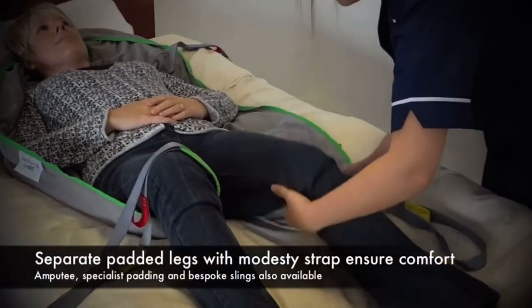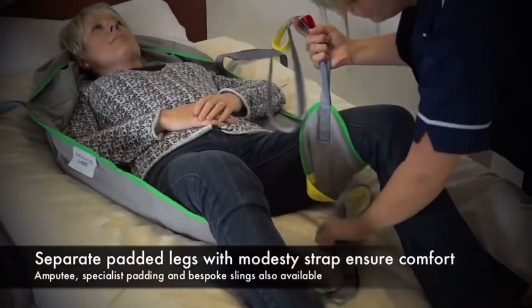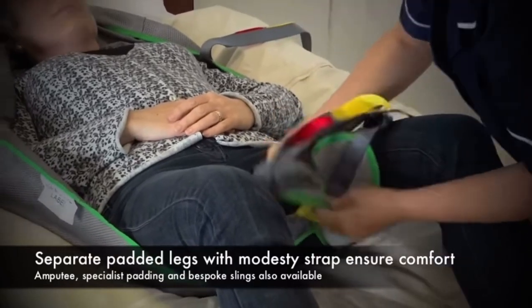The legs are then introduced into the sling around the client's legs, with one leg just being pulled through the modesty strap. This prevents the legs from splaying apart.